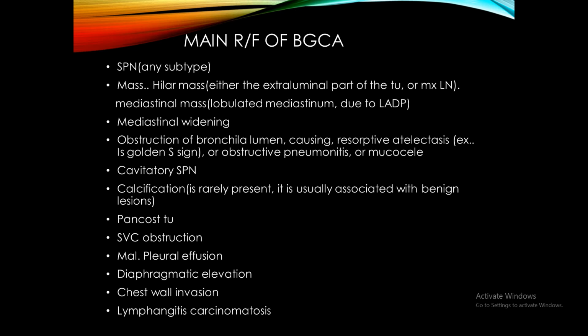لو نلاحظ هذه القائمة الطويلة من الراديولوجيكال features of bronchogenic carcinoma ممكن أختصر لكم هي بهذا الشكل. البرونكوجينيك carcinoma can be presented with any radiological features in the chest X-ray. Could be nodule, mass, patch, cavity, focal, diffuse, pleural effusions, diaphragmatic, chest wall, lymph nodes in the mediastinum, in the hilum, rib destructions. Whatever you think, it can present with this feature. فإذا في كل chest X-ray راح تمر علينا راح ننطي الكي features اللي توصلنا إنه هاي البرونكوجينيك كارسينوما.